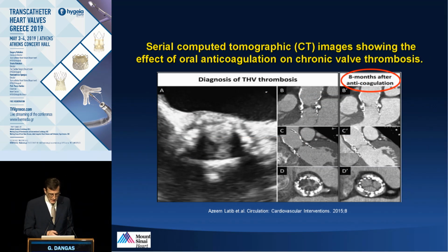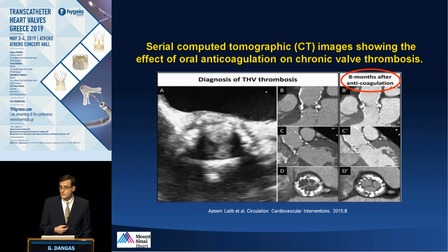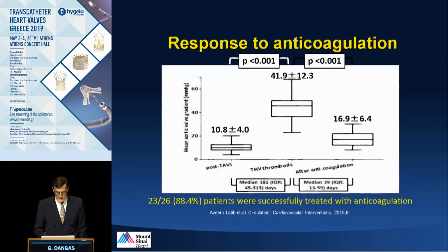There were several images that indicate that some of these findings may actually disappear with anticoagulation over time, and the valve can become beautiful and clean. In the end of the day, we call that the therapeutic criterion. This means that the fact that it cleared after anticoagulation proves the diagnosis was clot. So one can say that when you have this phenomenon, and the patient is not so symptomatic, even if the imaging diagnosis is doubtful, you may try to apply the therapeutic criterion: anticoagulate for a few months and repeat the imaging, and if whatever was there clears, that may support that indeed there was some thrombosis that was treated successfully.